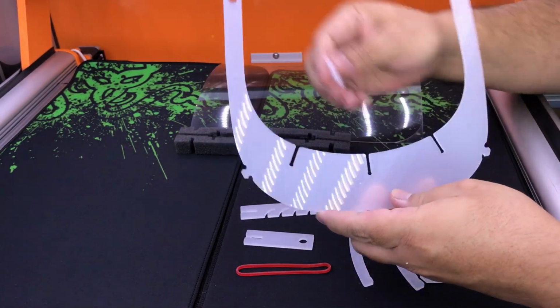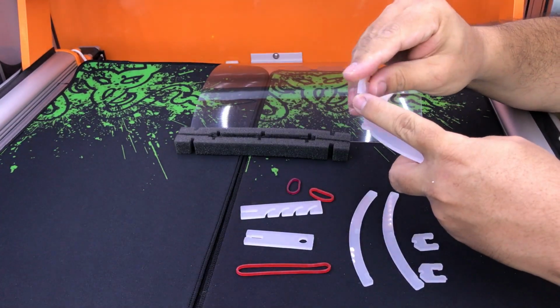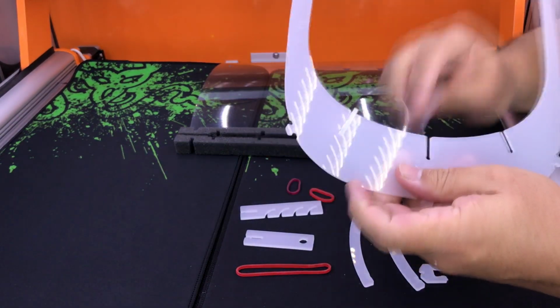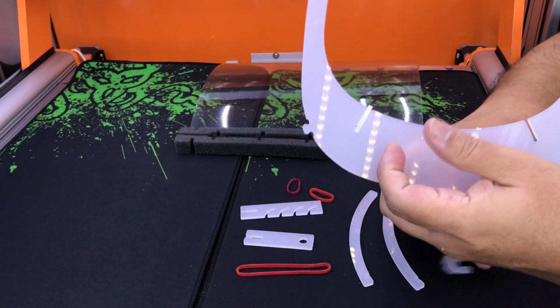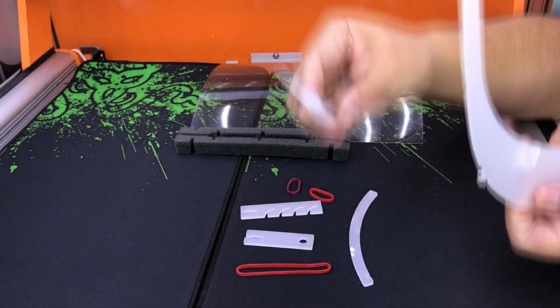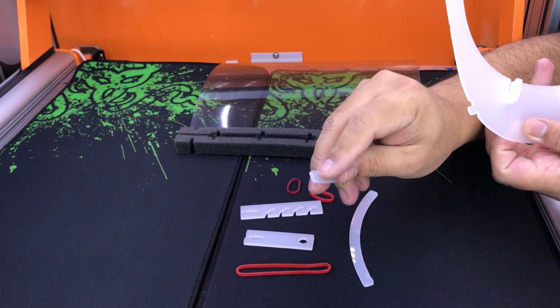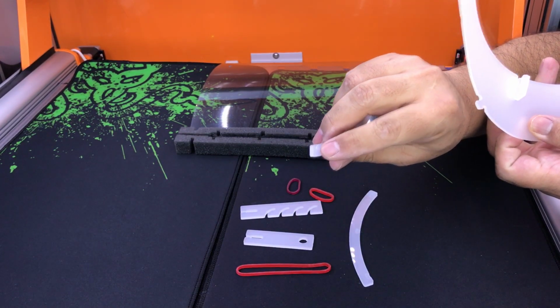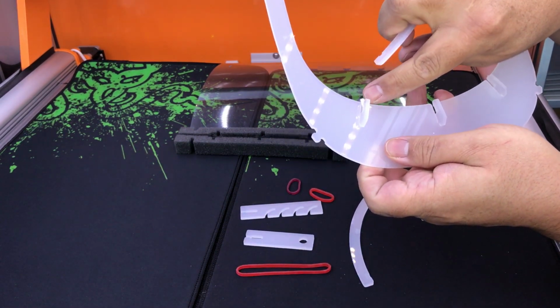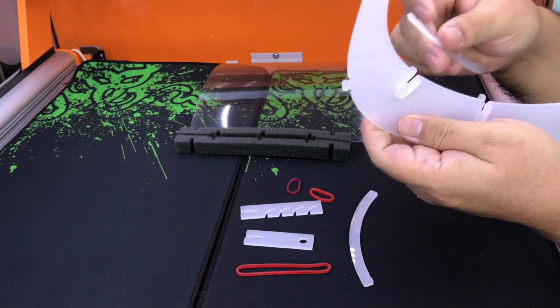Here on this part, you need to attach these parts like this. It has a little cut that goes inside the acrylic like this, so it stays in place and doesn't move up and down. After you put the three parts, you have to put one of these. On the design, you can feel that there is a small pocket on one side, so this pocket goes to this side up or this side down, so it holds the clip in place.